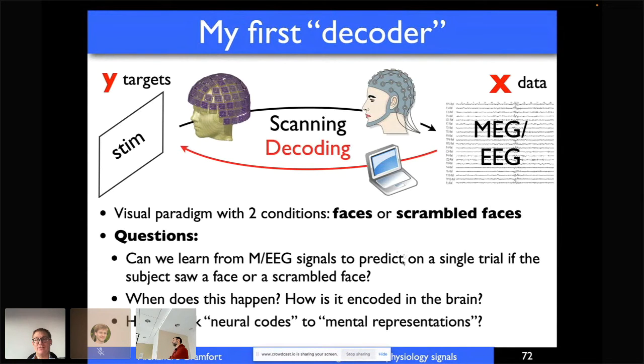So with what, but taking data at which time instant, maybe taking data in which frequency, taking data in which subset of channels. These are the types of questions that you can ask. What you care about often is, okay, can you make some kind of conclusion of where it's also happening in the brain? That's a bit more tricky. The when is much easier with EEG and MEG. And then what are the features? What makes the model actually work?